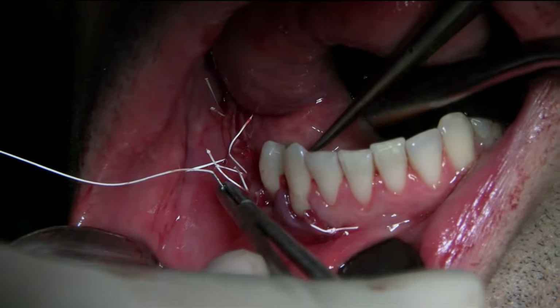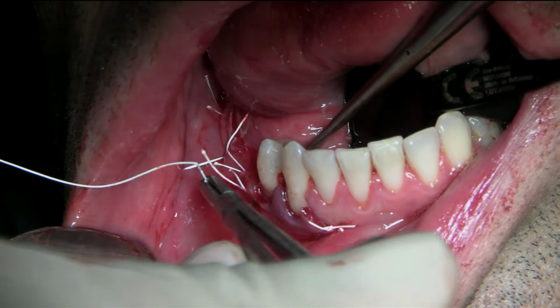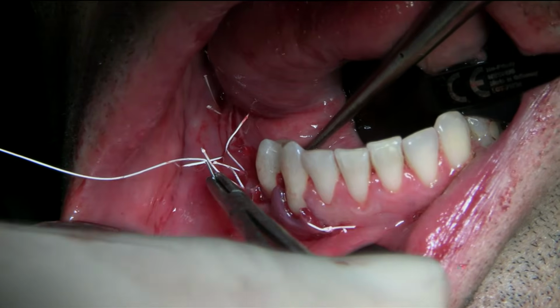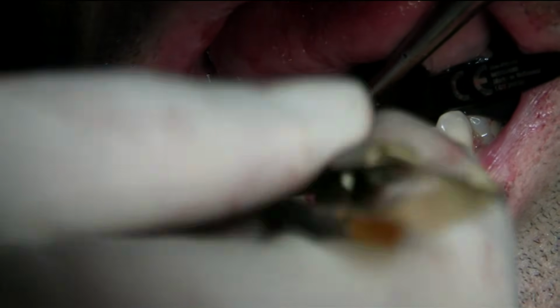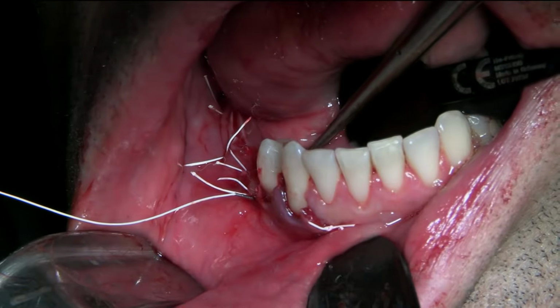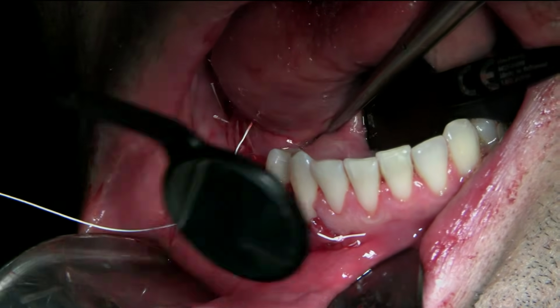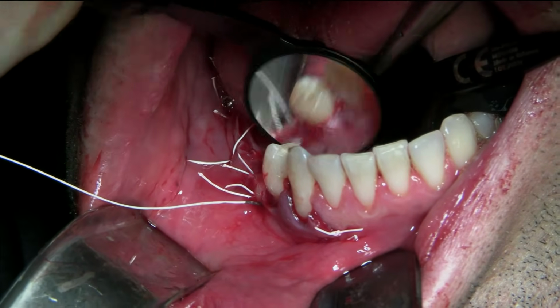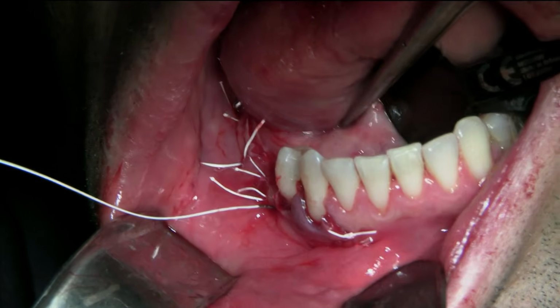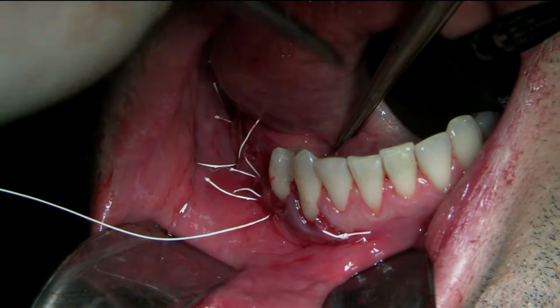No? I don't see it grabbing anything. Where's the mirror? I can't see the lingual. See it now. Oh, no, it's good. It's in the flap. So I grab the flap lingually as well.